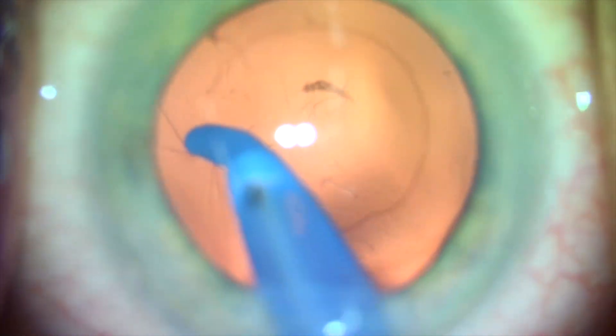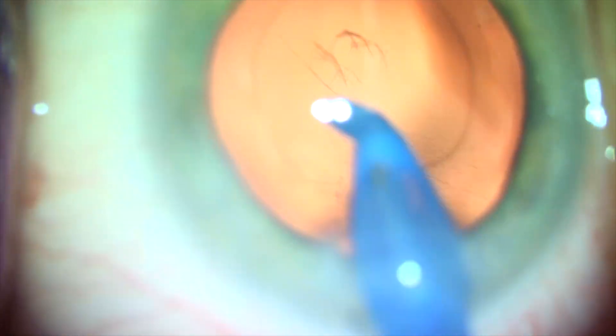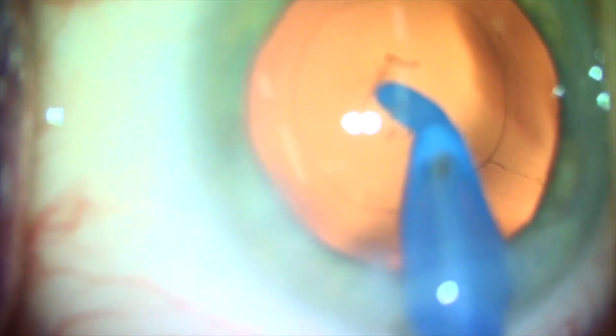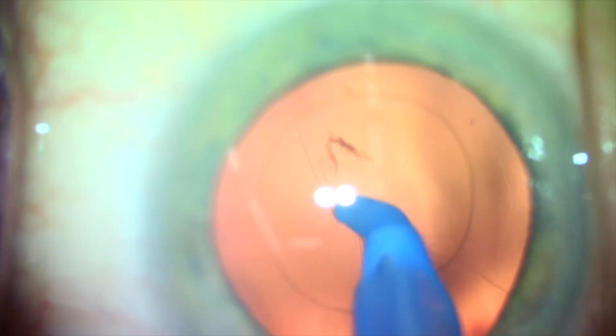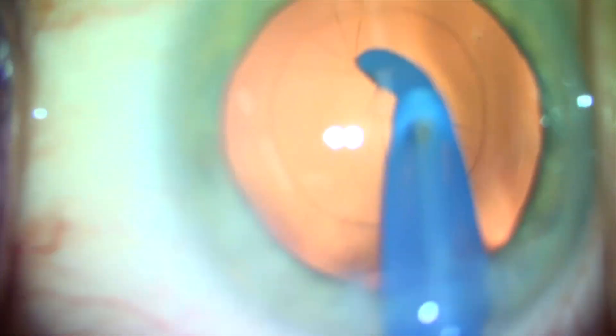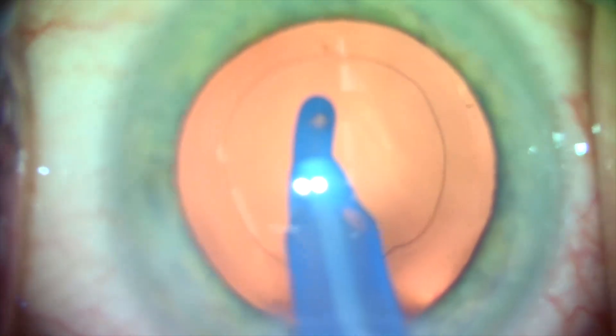To polish the posterior capsule, I directly aspirate the posterior capsular fibers under low vacuum. I am careful to only move the aspiration tip and aspirate the posterior capsule moving in a linear or curvilinear motion from bottom to top or from side to side.